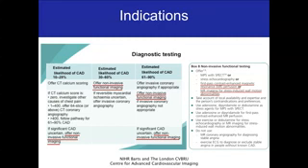Now, if you're intermediate likelihood of coronary artery disease, then you should offer a non-invasive functional imaging test straight away. So no coronary calcium score, but one of these tests straight away. In our setting, this is frequently MR perfusion scans. If you've got a higher likelihood of coronary artery disease, then you should really offer invasive coronary angiography immediately. For some reason, this may not be the first choice because the patient may not want it, or there are other reasons. In this case, it is okay to offer non-invasive functional imaging tests. And again, in our situation, this is often MR perfusion scans.